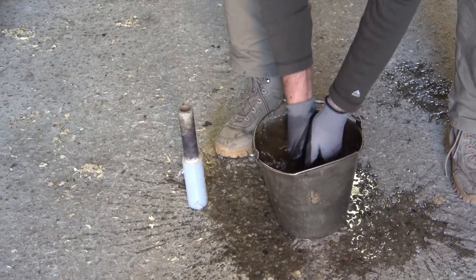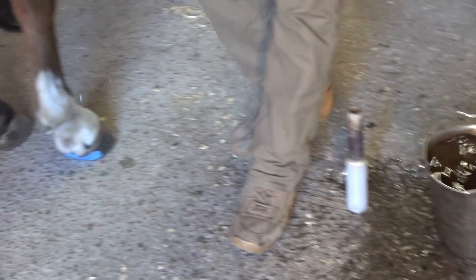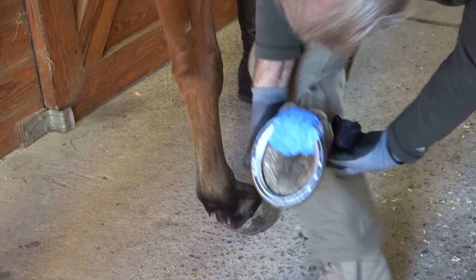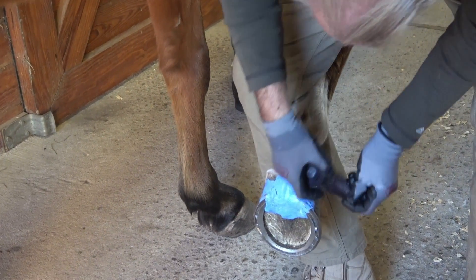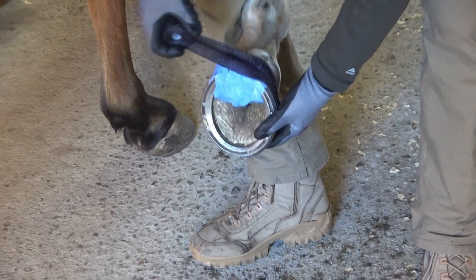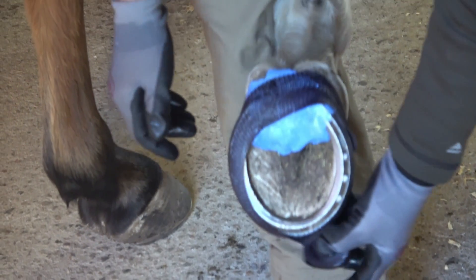Place your equicast in a bucket of water for a minute or two, and then lightly roll the cast in your hands to make sure water has soaked the cast completely. Attach the end of the cast to the anchor nail and unroll the cast over the closest heel, passing just under the coronary band.